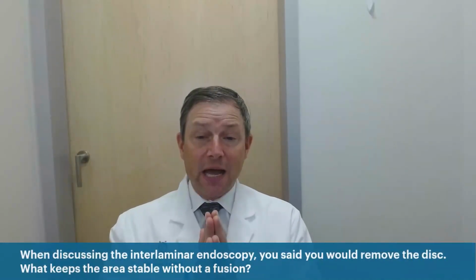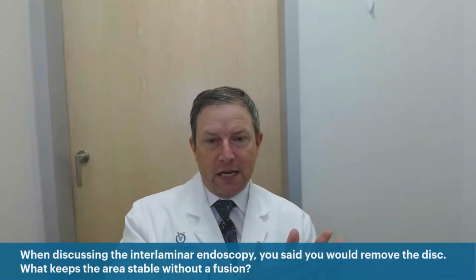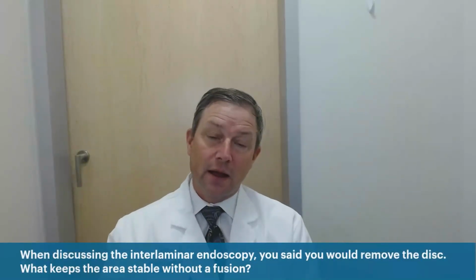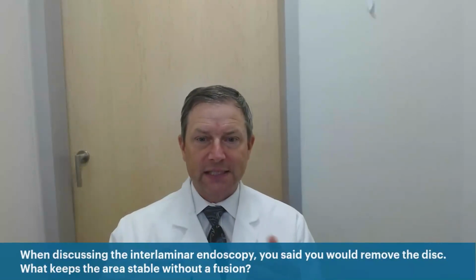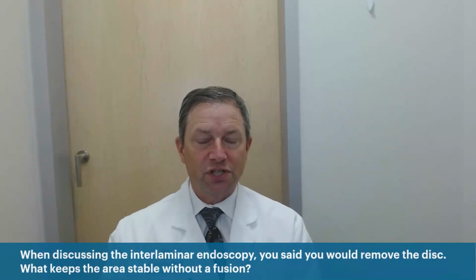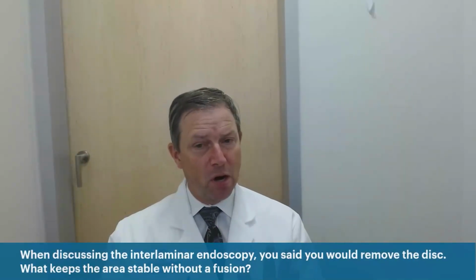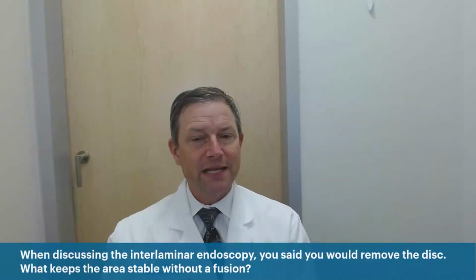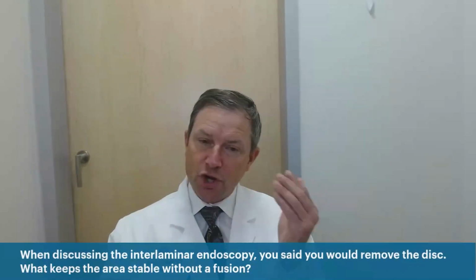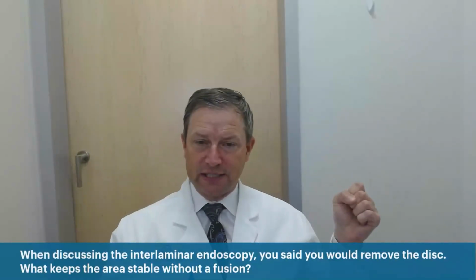The beauty of interlaminar endoscopy is that I have to remove even less bone to get to the ailment, and so in theory, you create even less instability. So to answer your question, when removing this, what keeps the area stable? The answer is mostly bone, mostly the facet joints in the back. And even though we take out the disc, in general, when we do a microdiscectomy, you're not taking out the entire disc that's up in the front.